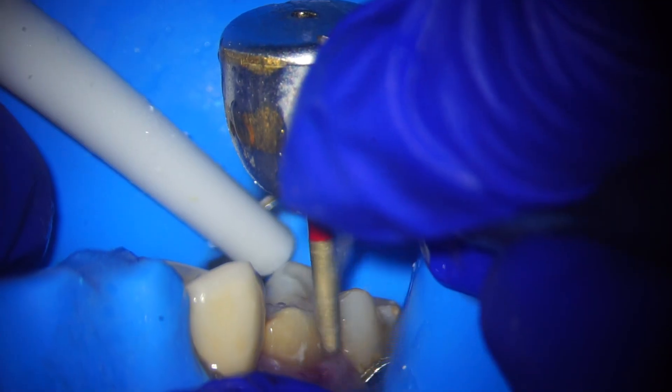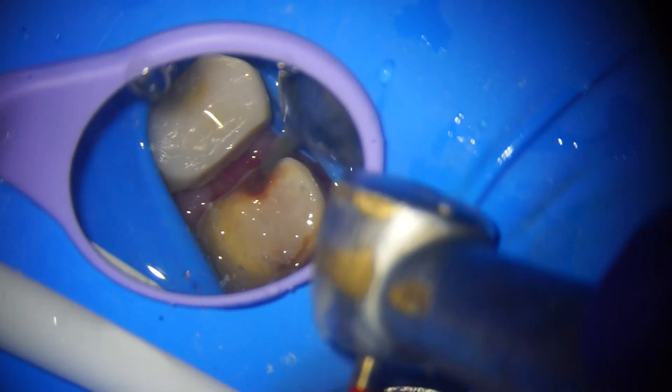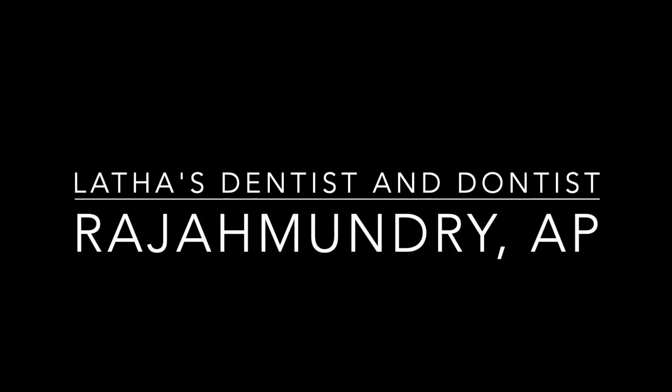Some dentists have asked me: is it possible to do crown prep under the microscope? Yes, it is. It all depends on how you orient the patient and the tooth, and visibility maneuvering the microscope. It is easy and predictable. There is decay there and we have done the restoration too after this. Thank you.